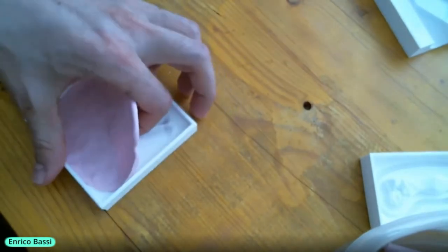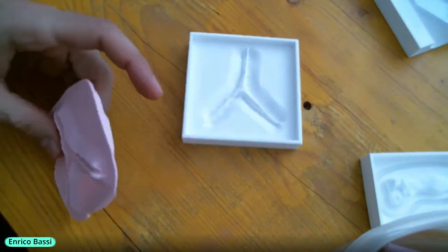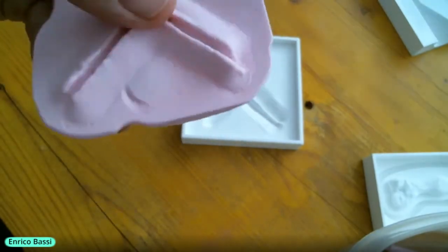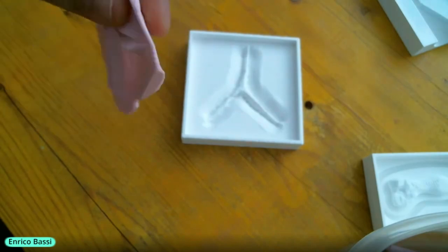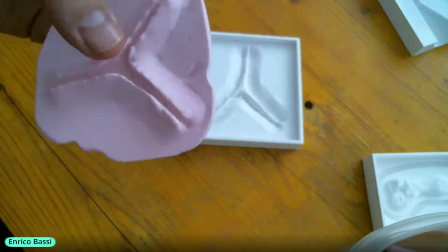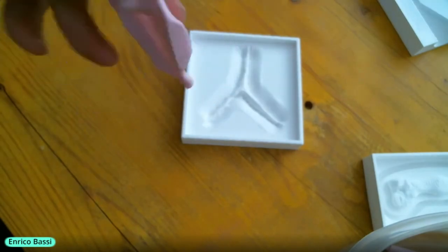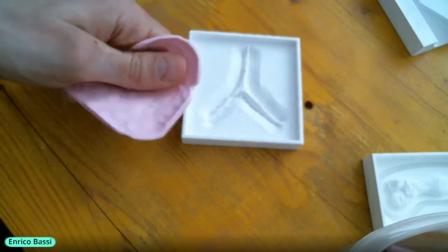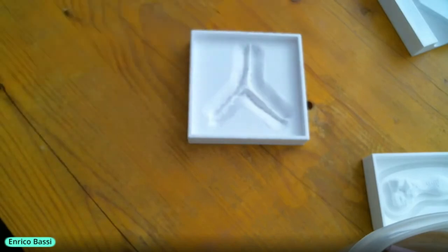Now, this is cured already. You can pull it out and you get your object. You see that here, for instance, there was a bubble. The layer is very thin, so I didn't manage to press it properly, but you got an idea. And you've seen it very fast. It's like 10 minutes and it's already rubbery. Cool.